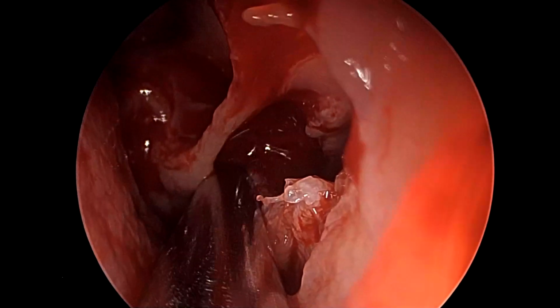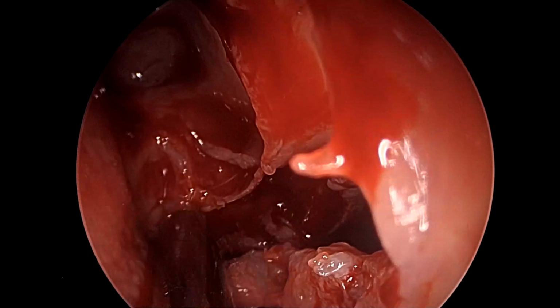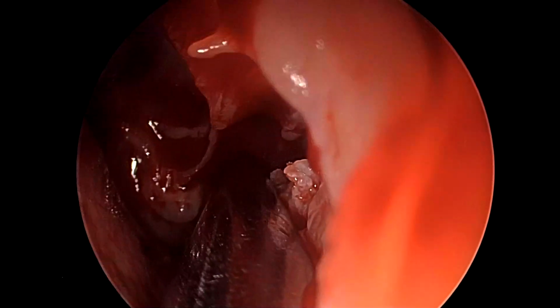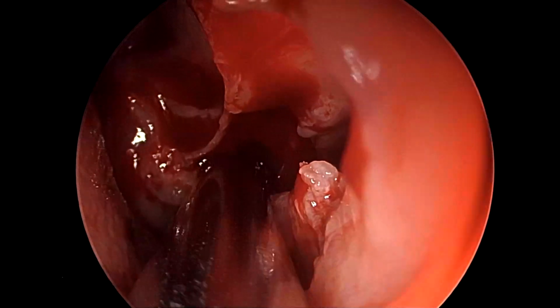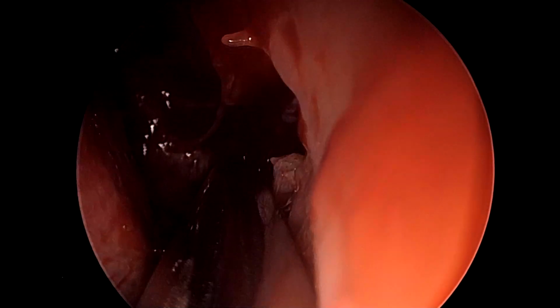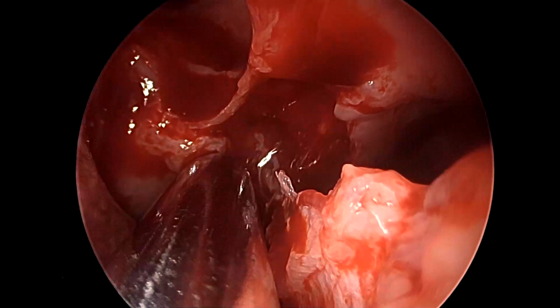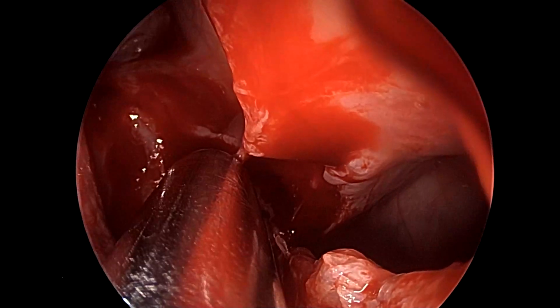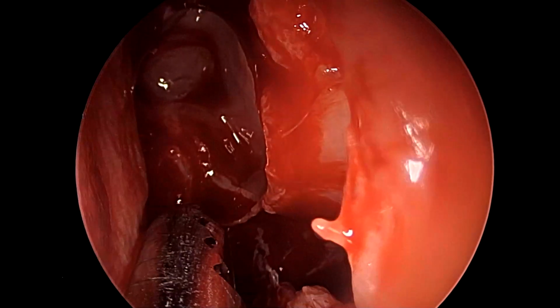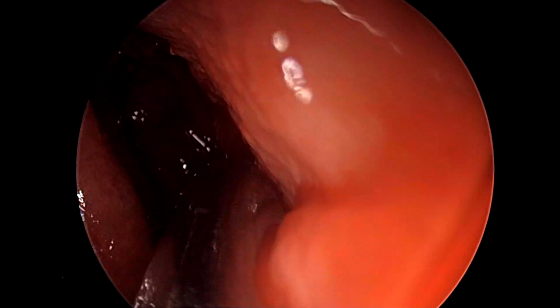So while the shaver is a great tool here to enlarge the maxillary antrostomy, and remove the excess bony chips and the redundant mucosa over both the ethmoids, the antrum opening, as well as surrounding the defect, it must always be used with caution, with very precise hand control and foot control, with the blade always in vision. In case the bleeding is a little uncomfortable and the field is not good, it is highly recommended that the field be optimized before proceeding further, as any error in this step of surgery could compound to create a lot of difficulties eventually at the time of actual repair.